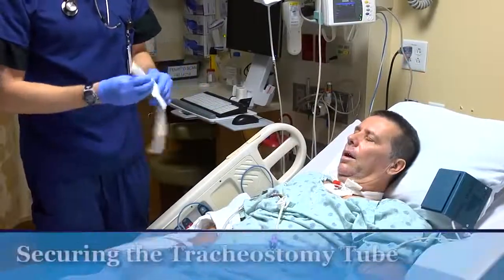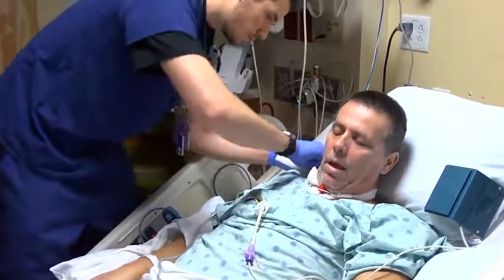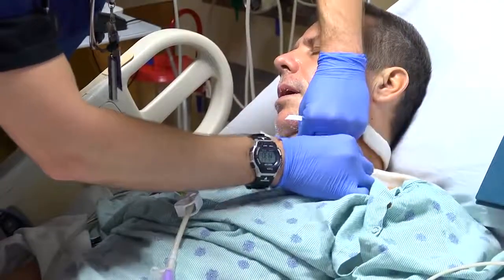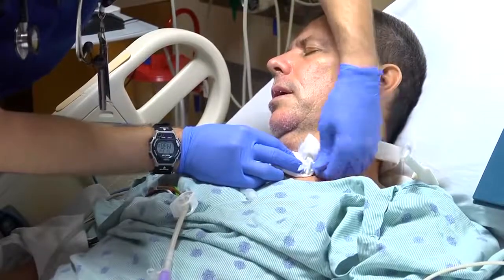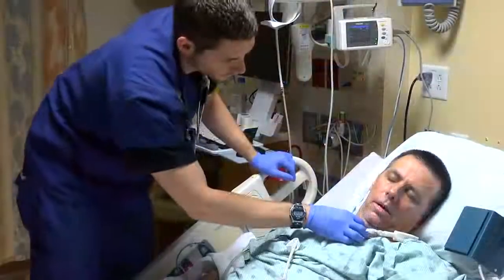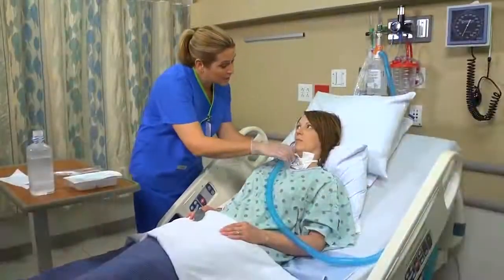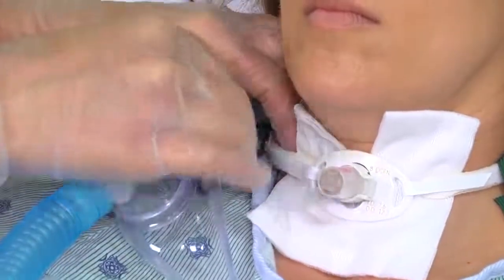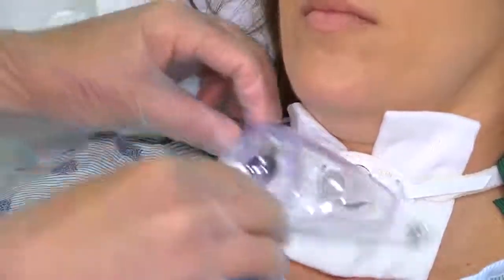To secure the tracheostomy using the tube holder method, you may want an assistant to hold the tracheostomy tube as you work. If an assistant is not available, leave the old tracheostomy tube holder in place until the new device is secure. Align the strap under the patient's neck — the Velcro attachments should be positioned on either side of the tracheostomy tube. Then place the narrow end of each tie under and through the eyelets on the faceplate and secure the Velcro closures. Verify that the neck strap has only enough slack for two fingers to fit snugly beneath it, or for one to fit loosely.